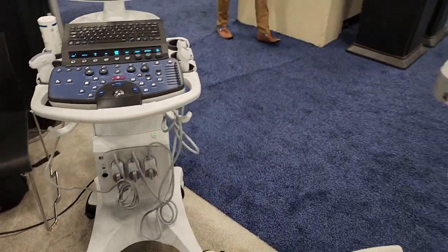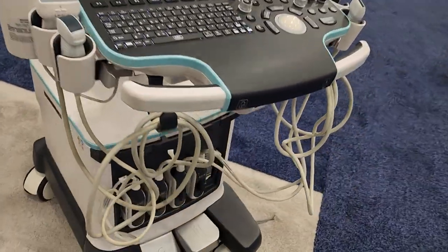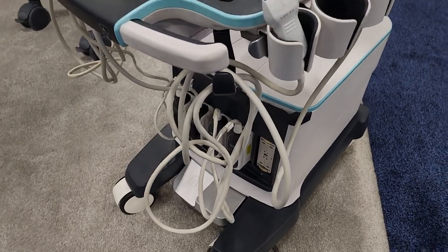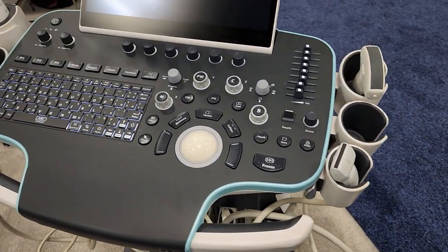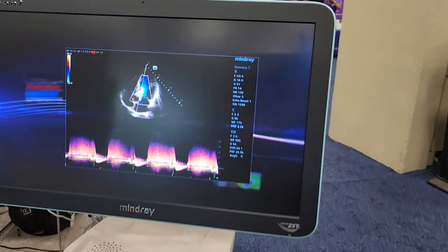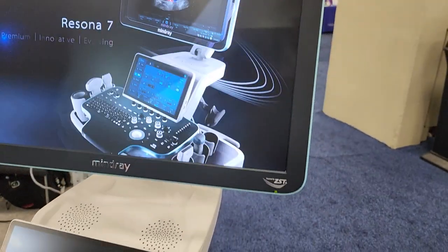That is a well thought out machine. And then we've got the Resona 7 — as you can see, it's got the ability for 4 or 5 probes to connect. Again, check out the layout — we've got dual displays. What a cool demo to be running on your machine.